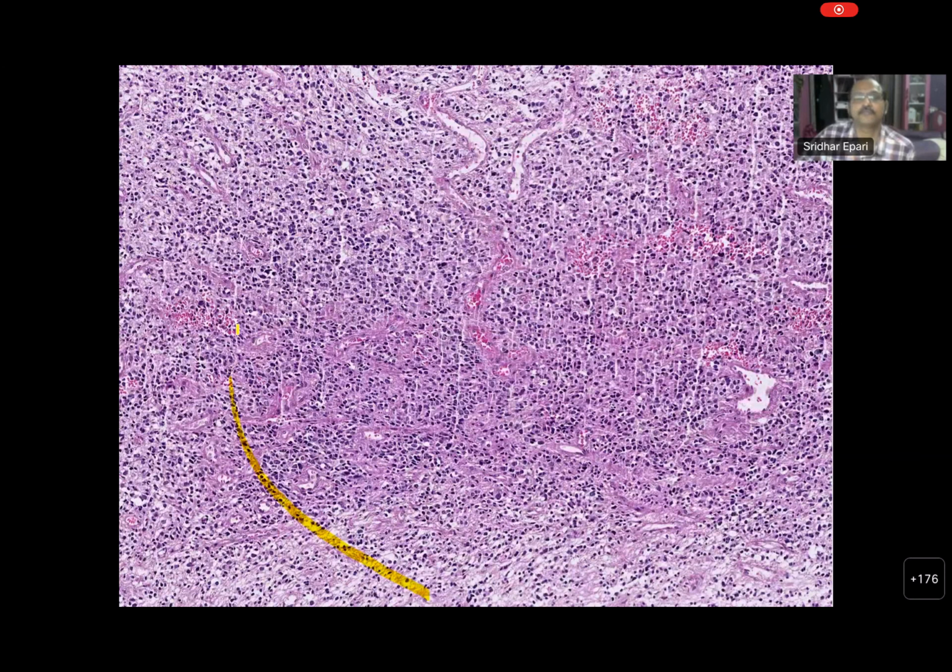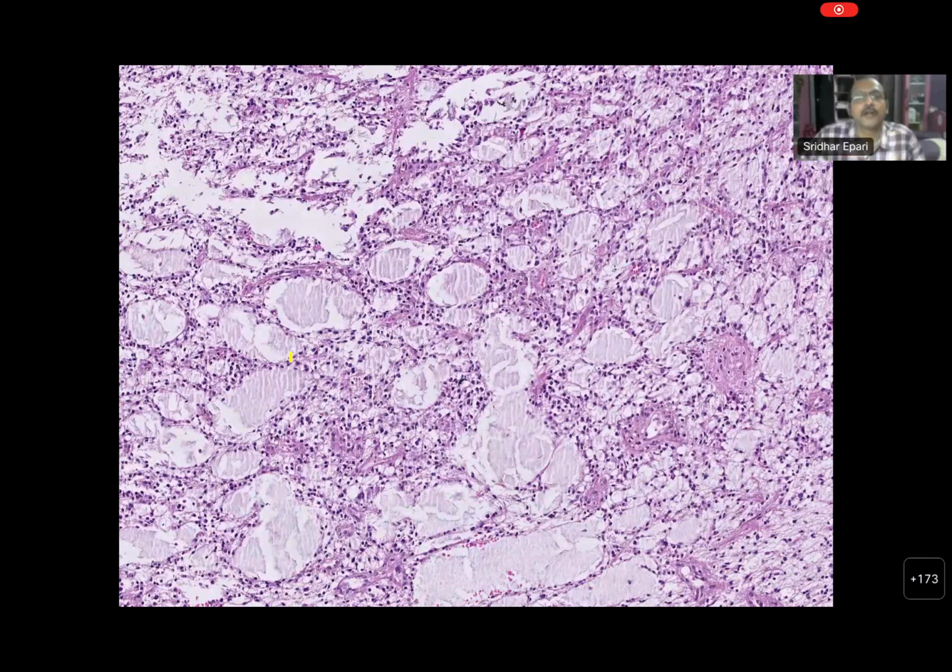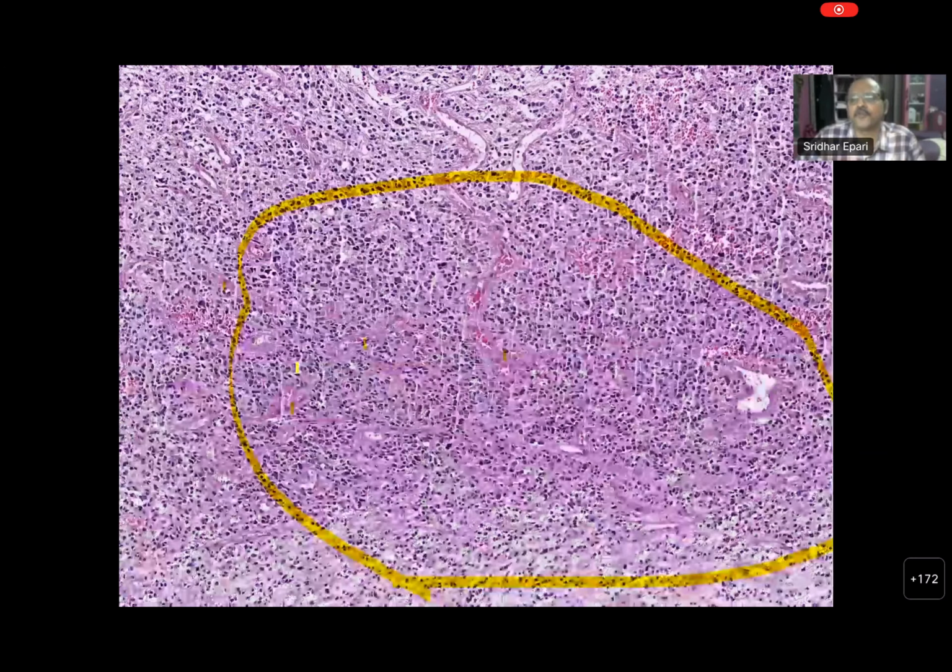That area has compact cellularity, a cellular crowding type. There is hardly any space between the tumor cells, which are arranged compactly and show variation in size. These are vessels, proliferating blood vessels, and these are the microcystic spaces in the higher power. So they are not really microvascular proliferation; they are subtle, but doubtful.